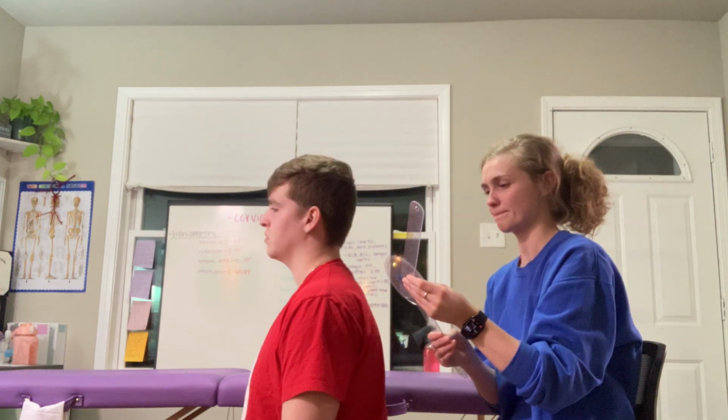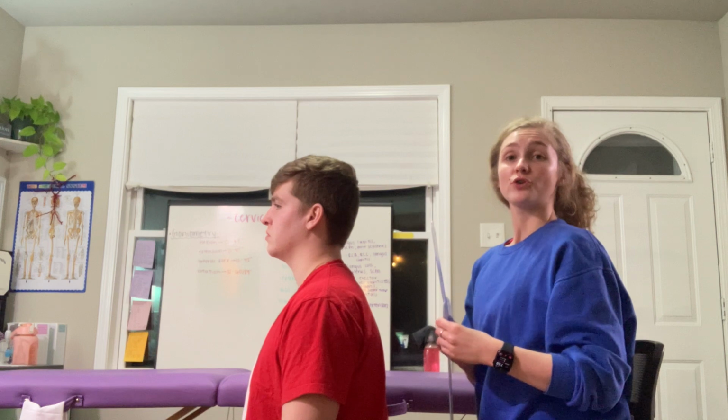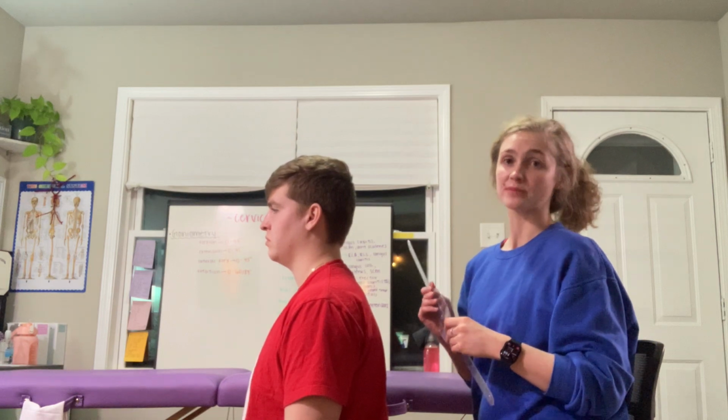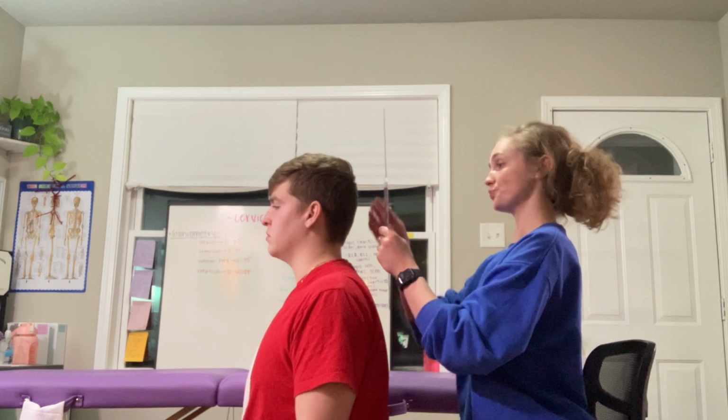Alrighty. Our patient has given us 39 degrees of cervical flexion to the left-hand side, which is going to be less than the normal range of motion, which is 45 degrees. Let's see what Nick's range of motion on the right-hand side will be.